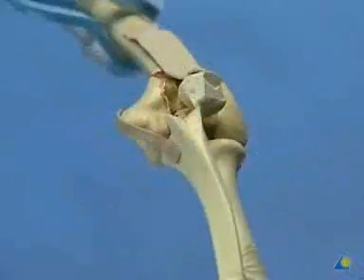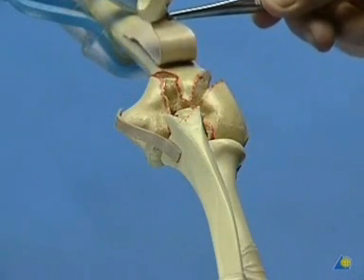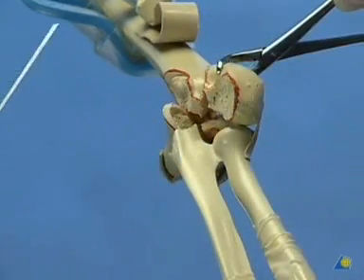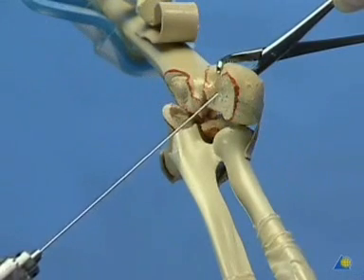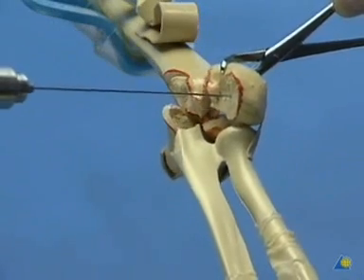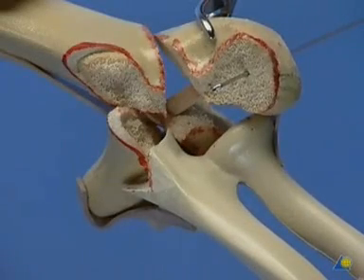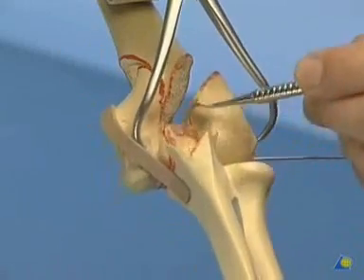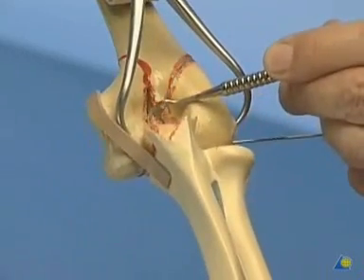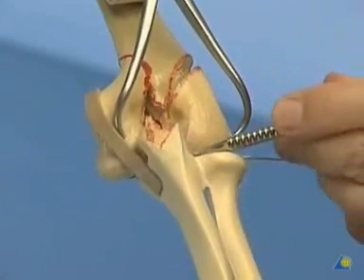With the fracture situation assessed and the bone surfaces cleared of hematoma, the reconstruction may start. In case of an intermediate fragment between the capitellum and trochlea, it is advisable to first drill a K-wire into the radial fragment by means of the inside-out technique. The blunt end of the wire is sharpened by an oblique cut. A special 1.25 mm wire with threaded tip is selected because a cannulated 3.5 mm cancellous screw is to be used. The fracture is now anatomically reduced and held in place by a pointed reduction forceps, with care being taken not to damage the ulnar nerve.